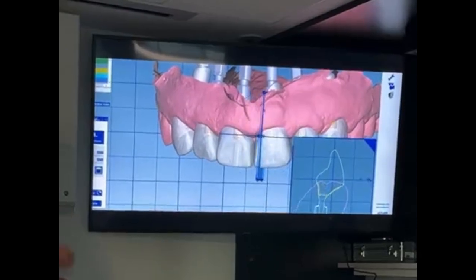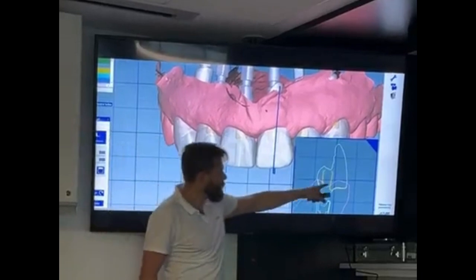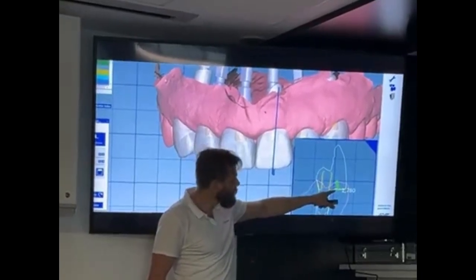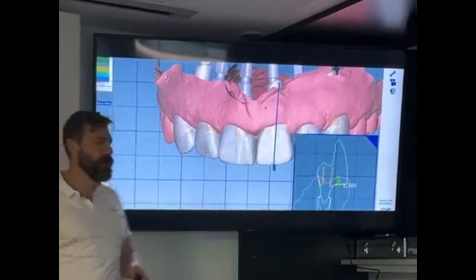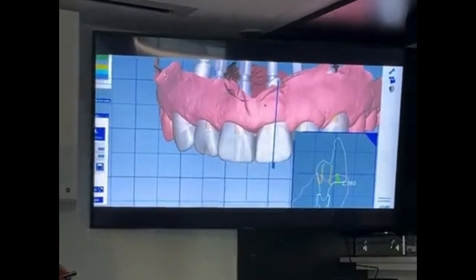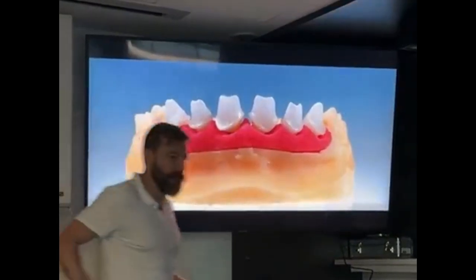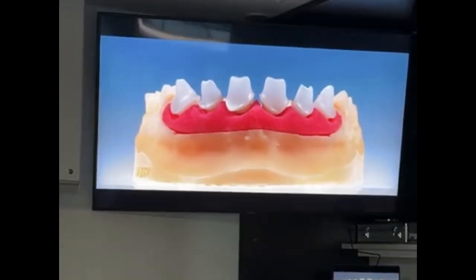But one interesting fact here is the distortion. In pink is the scanning with the scan body. In white and yellow is really the shape of the gingiva done by the provisionals, right? So 1.7 millimeters of distortion. I'm just going to close this window because of the noise, and we're going to let the other one open. Okay.